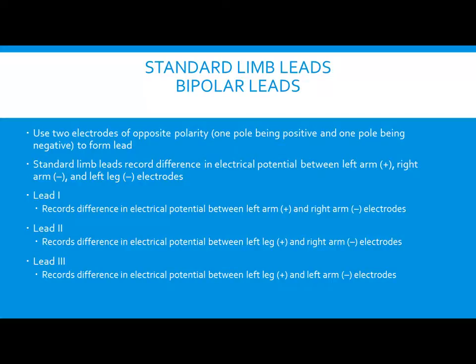Same thing with lead 1. And then the same thing with lead 3. Lead 3, we're going to have a positive left leg and a negative left arm. So it's going to get more of a look at this side. All right?